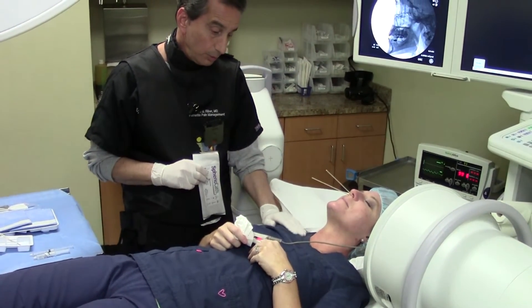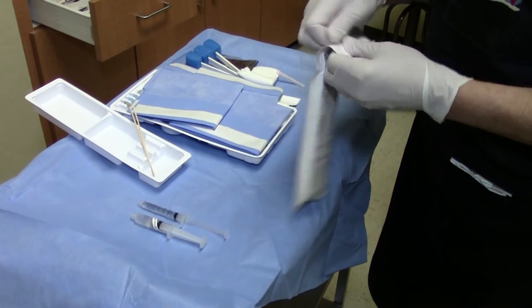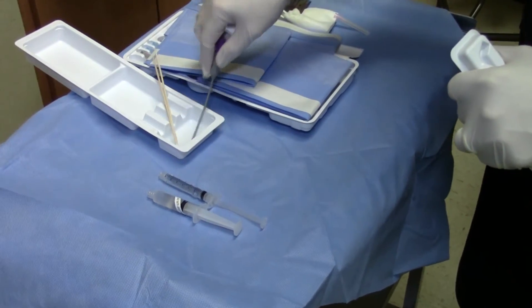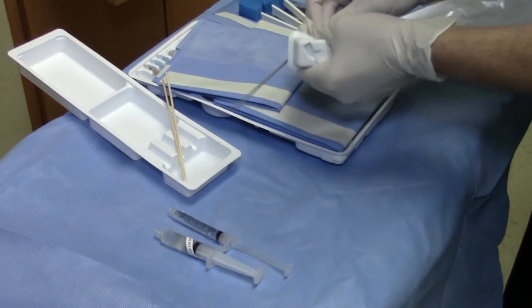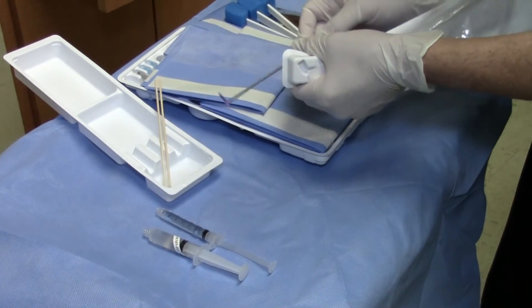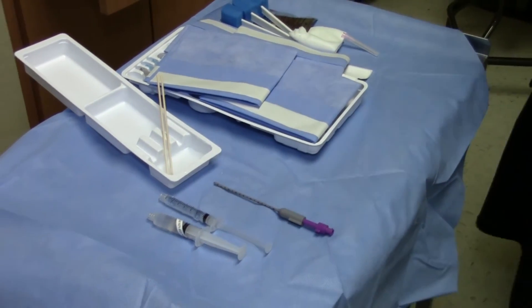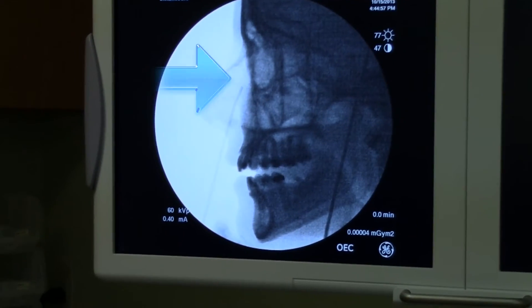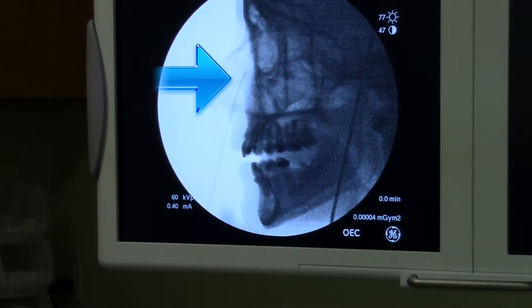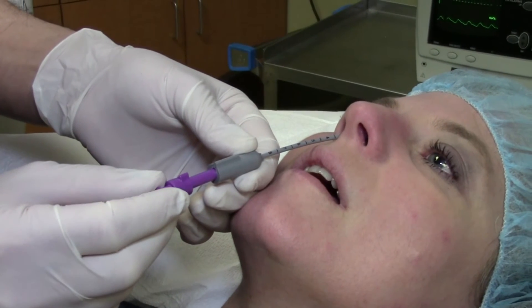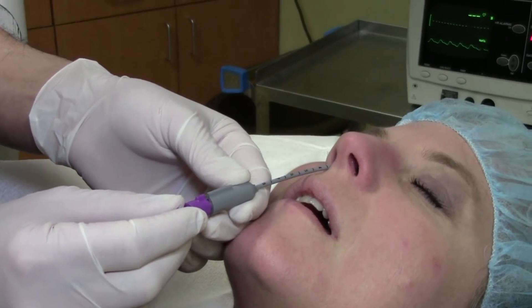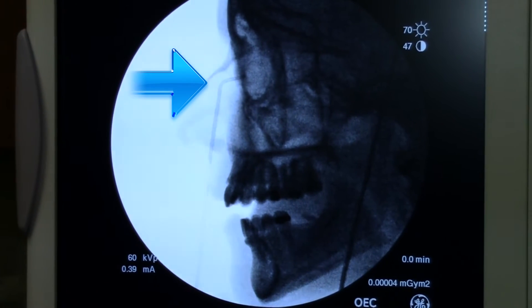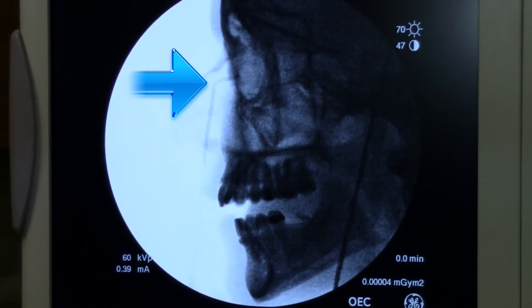I am going to lubricate the sphenocath with some lidocaine jelly to ease its passage through the nares to a site just below the floor of the frontal sinus. I am slowly advancing the sphenocath to just below the frontal sinus floor. I am now going to deploy the inner catheter, which is now making a right angle pointing posterior along the middle turbinate.